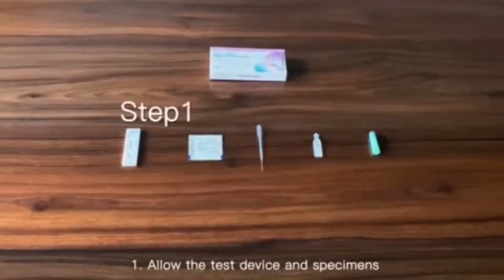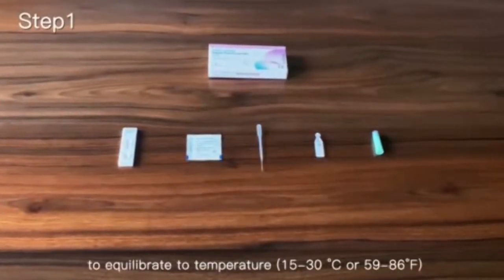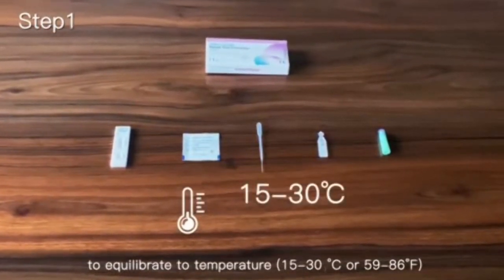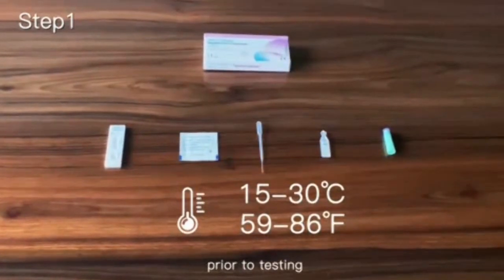Step 1: Allow the test device and specimens to equilibrate to temperature 15 to 30 degrees Celsius, or 59 to 86 degrees Fahrenheit, prior to testing.